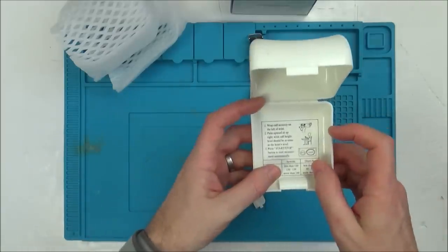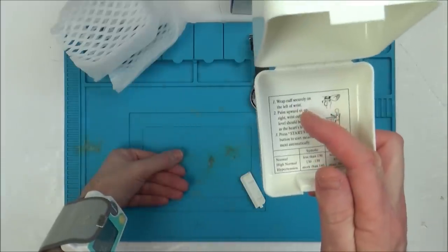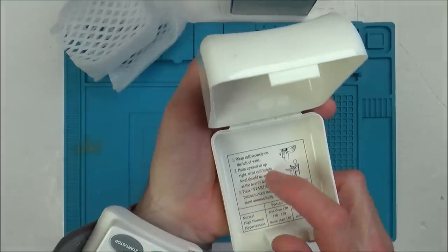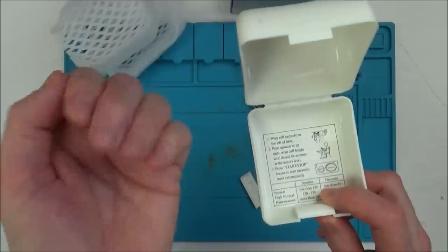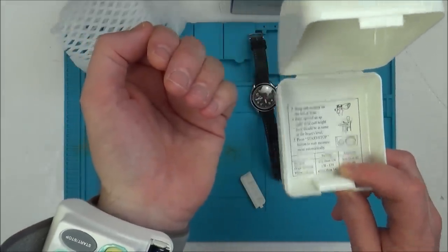It does say to put it underneath as well. Wrap cuff securely on the left of the wrist, showing palm up. Palm upwards, sit upright. Wrist cuff height level should be the same as the heart. Press start/stop button to start measurement automatically.